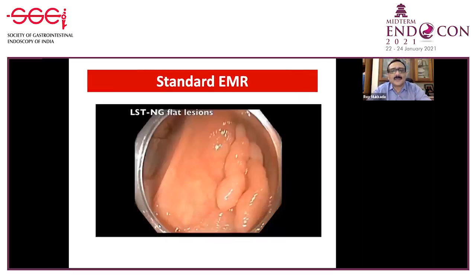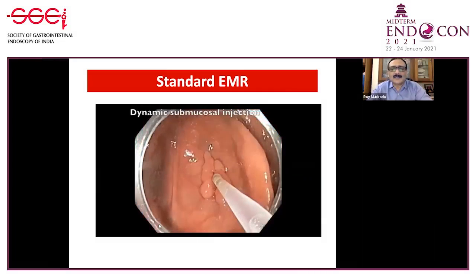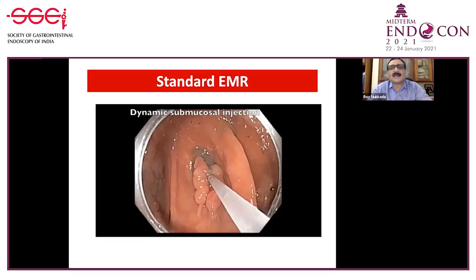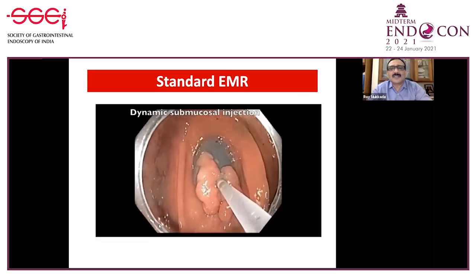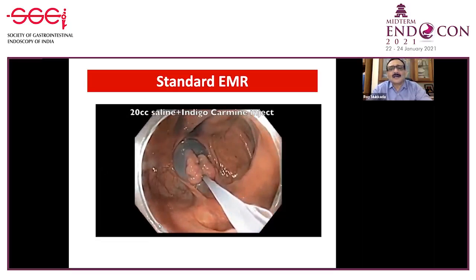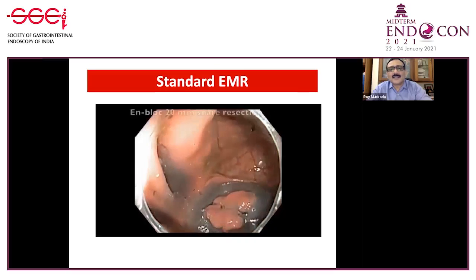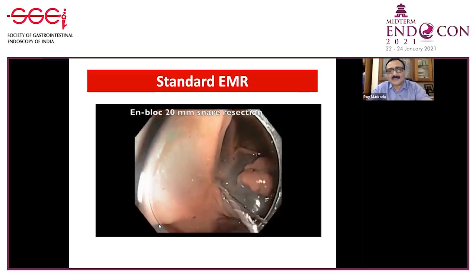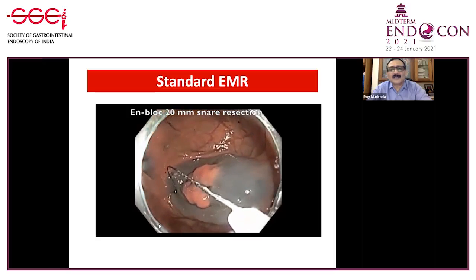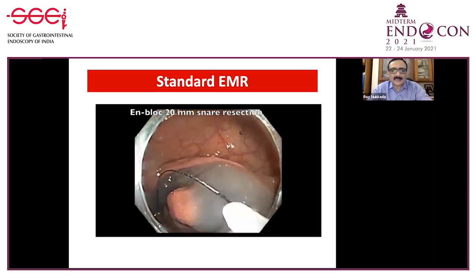This is a classic, simple video which I've taken from the collection of Dr. G.S. Raju, and it's a very neatly done EMR. First, you do a submucosal injection with a lifting solution, which can be anything, but which has to stay for some time. So you can use whatever is available. And then you use a snare, a 2 centimeter snare is used here. Catch the lesion just below its borders, and then close the snare and resect it.